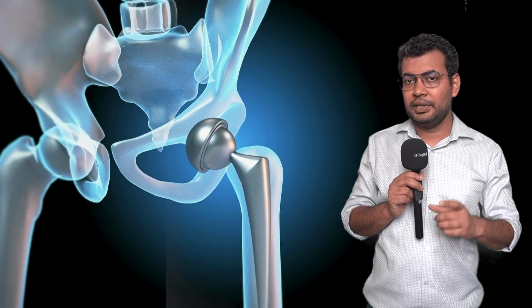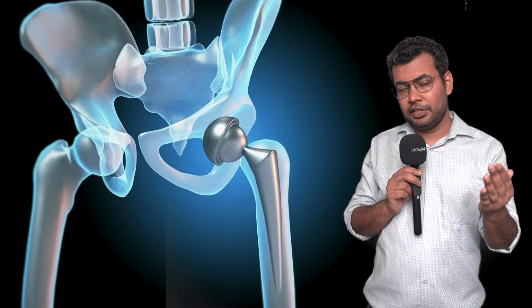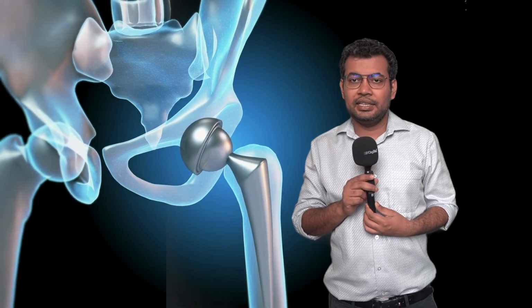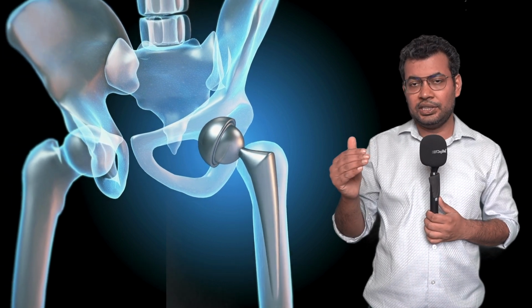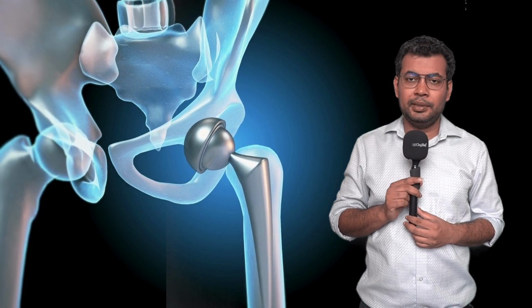For example, if the tumor is 18 centimeter, then we will have to do 2 to 3 centimeter extra. We measure from the tip of the GT and we cut 20 to 21 centimeter, for example. And the third thing is we need to know the neurovascular status with the tumor. We should know the distance of the tumor from the sciatic nerve and from the femoral vessels and the profunda vessels. So keeping this in mind, we plan the surgery.